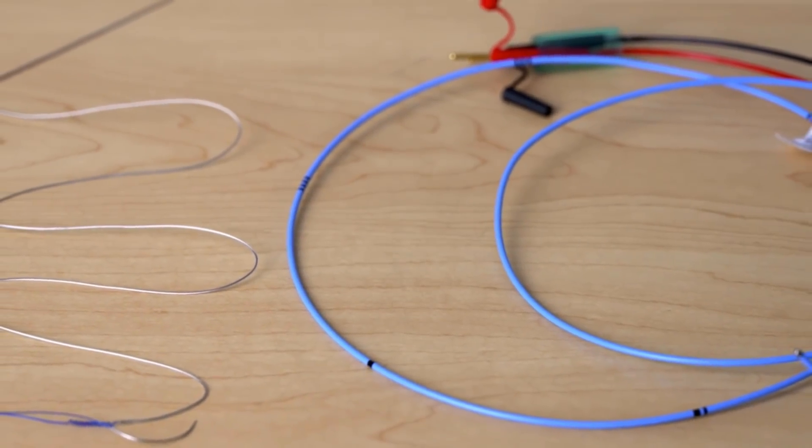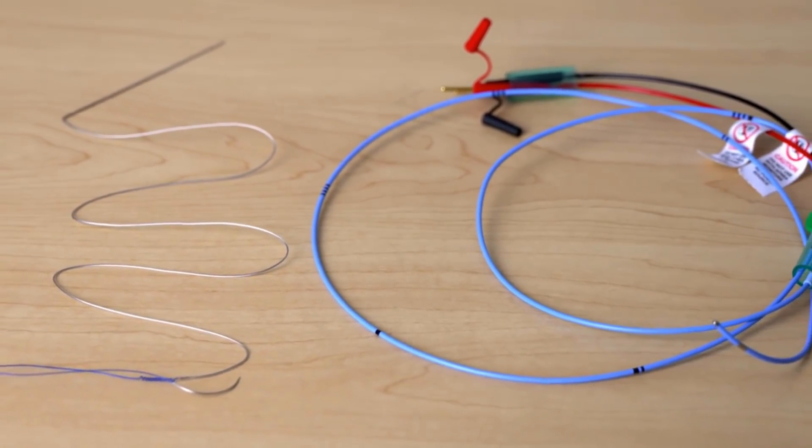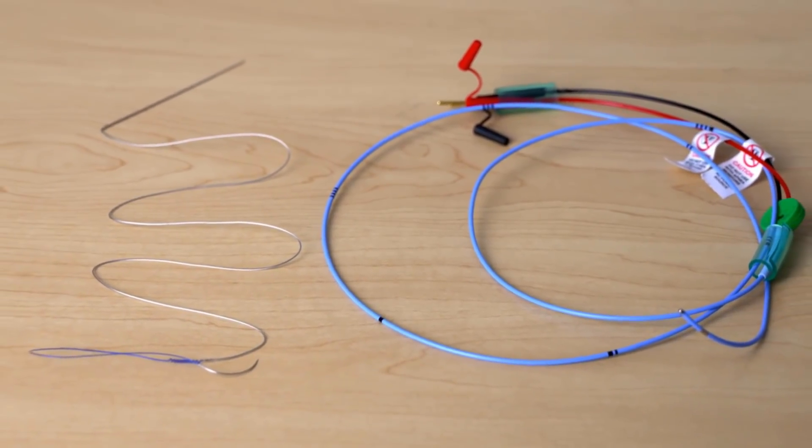These wires and leads connect to a cable which connects to the external pacemaker. So the pacing leads or heart wires don't go directly into the external pacemaker? Correct. A cable is always needed to connect the pacing catheter, lead or heart wire to the external pacemaker.